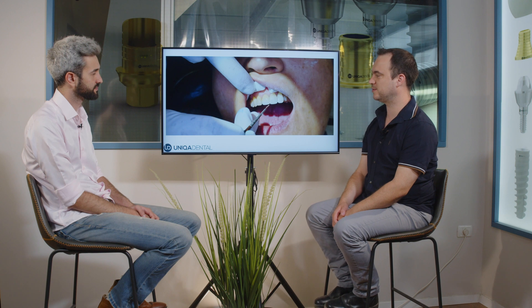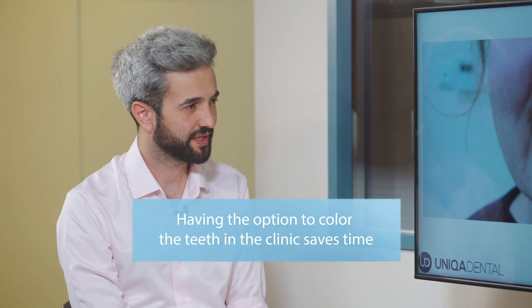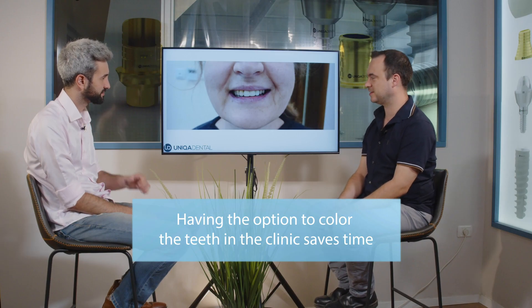Then we made a very beautiful bridge from monolithic zirconium. This is where we paint and adjust the colors of the bridge a little bit. This is after the painting — it's still not the final work. You can see the anatomy and the color are not quite 100% correct yet.